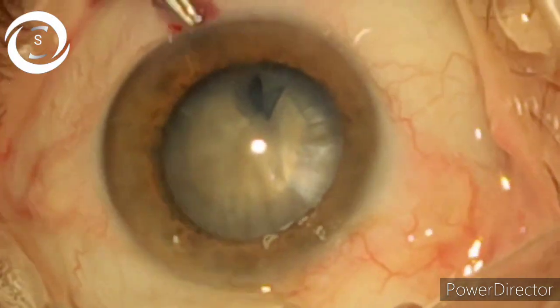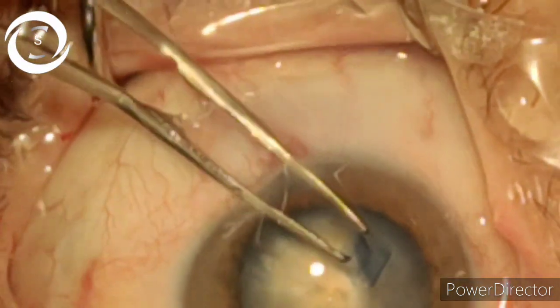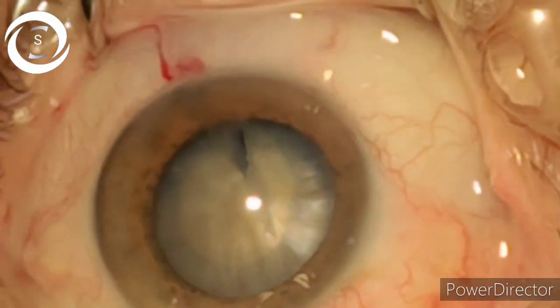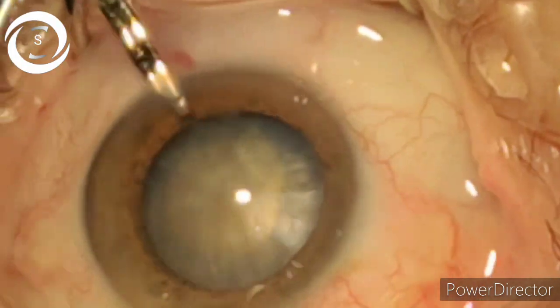And here we have completed the round capsulorhexis in a hard cataracta nigra. The rest is easy. That's how you perform capsulorhexis in a hard cataract.